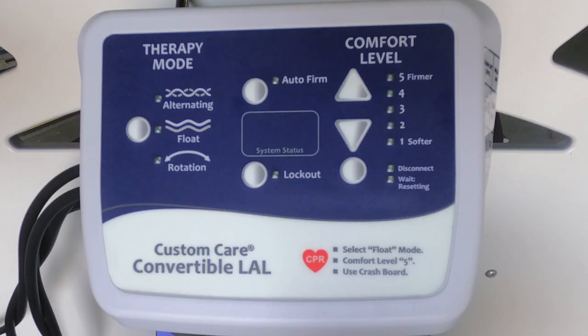Let's talk about connecting the control unit. It is designed to hang on the foot of the bed with hangers behind it here, and it also has an air filter with vents on the back of this controller. You should not obstruct those in any way with linen, so be wary of that and make sure that doesn't happen, because it could damage the controller. Also, the power cord comes out from the side, the left side at the bottom of the controller, just below the power switch. You want to make sure that your cord is resting freely on the floor for safety.